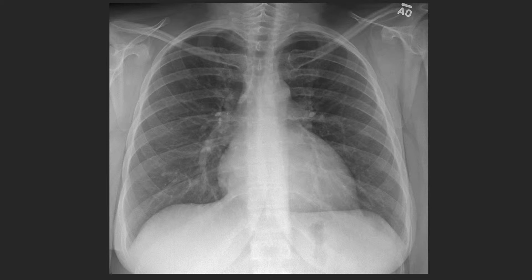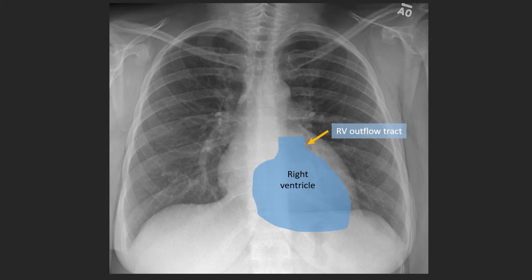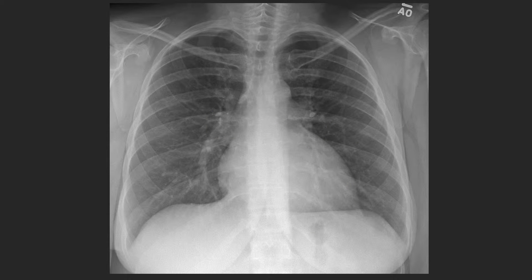Blood is now in the right ventricle, which is the most anterior chamber of the heart. On the frontal view it does not typically form a contour when normal in size. Blood leaves the right ventricle via the right ventricular outflow tract and exits the heart via the pulmonic valve, seen here in yellow, which is the most superiorly located valve and sits to the left of midline. Blood then enters the main pulmonary artery, seen here in dark blue, which creates a contour just below the aortic knob.